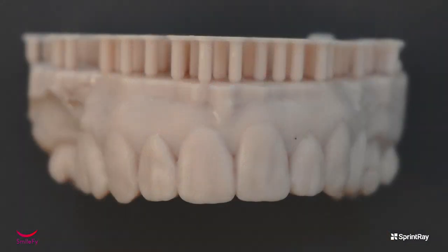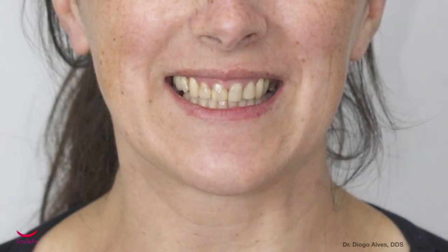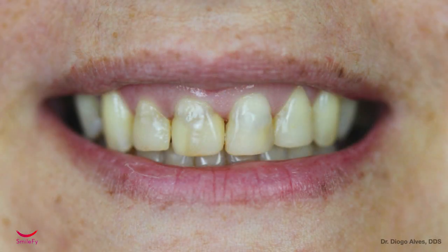Facially guided 3D wax-ups and mock-up trials should always be included as part of the treatment plan process to ensure the success of the treatment, as it combines the practitioner's clinical analysis while checking on the facial proportions and aesthetics.